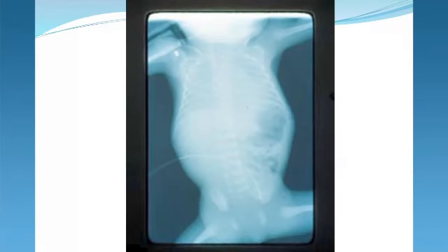And this is a baby with severe hyaline membrane disease. Now, this lung is so dense and so poorly inflated that this baby would probably need the mean to be 3 to 4 higher than what it was on conventional from that standpoint. With surfactant today, we get by with means in the 8 to 10 range post-surfactant.